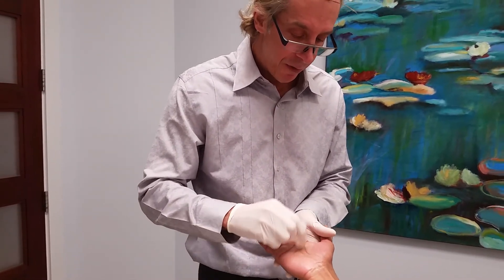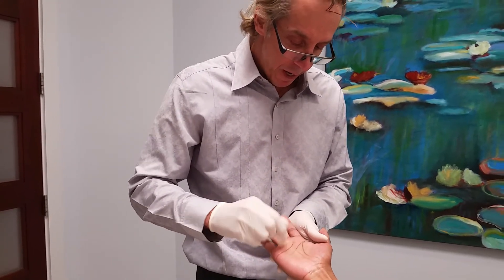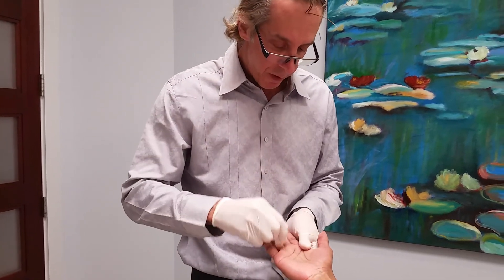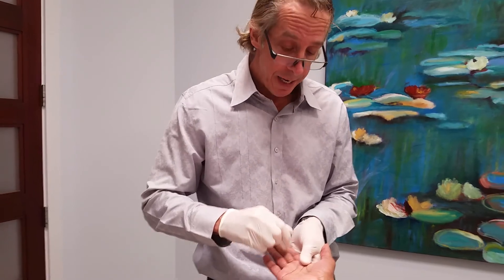So we're almost done. We use the dilute form of the dysport, and you get the idea — it's very easy to do. If you want more information, give us a call. Look us up on theclinique.net. Thank you.